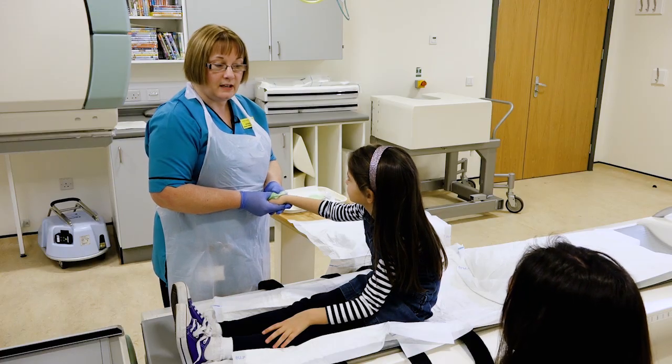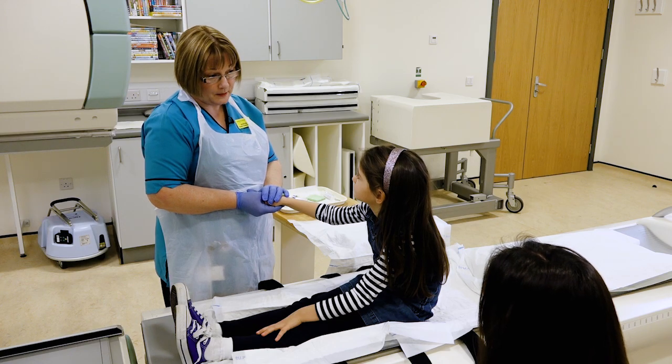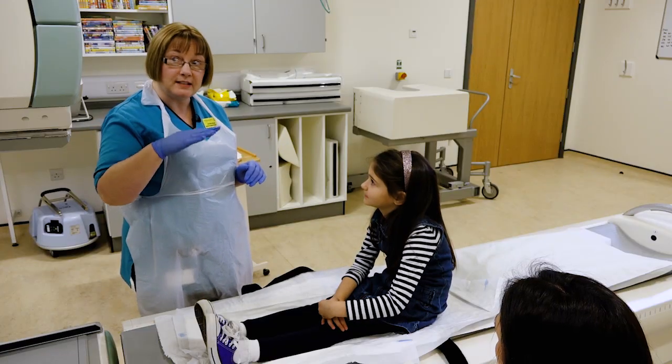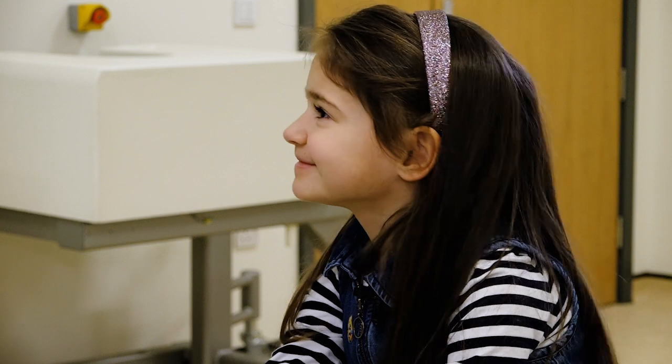Now we send you away for two hours. You can eat and drink and you can go to the toilet as normal. You can leave the hospital as well. Is the scan going to hurt? No, the scan doesn't hurt — all you have to do is lie very very still. It does come close to you and it is quite big, but it doesn't hurt, and we'll put on a DVD for you to watch so you can just relax and watch that.